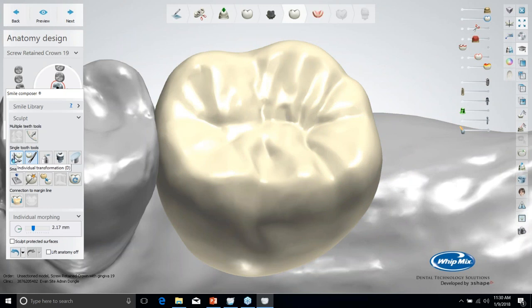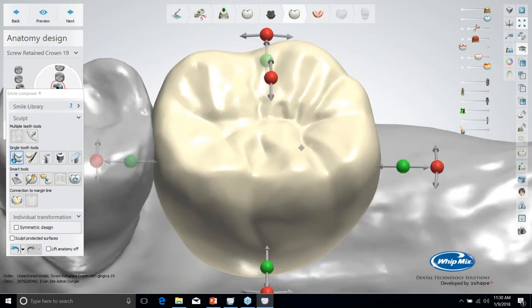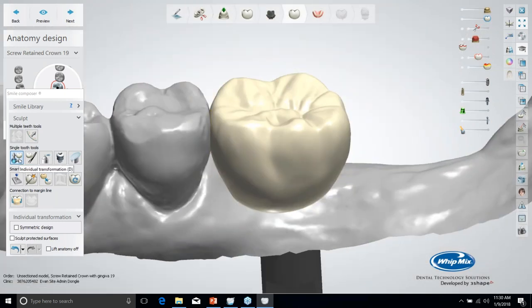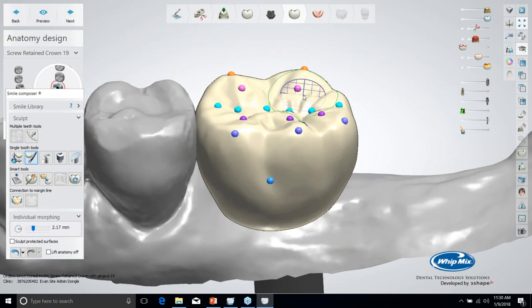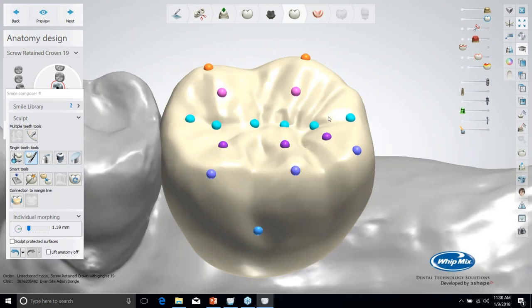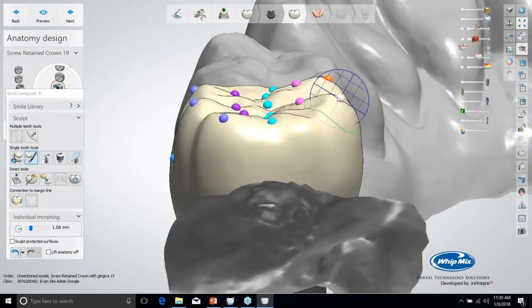But real quick, for anybody who hasn't used 3Shape or doesn't have CAD CAM, the first tool over here under single tooth tools lets you do large scale transformations to the crown. The green balls scale, red rotates, and the yellow will expand the occlusal table. So that's for large transformations. The next one is the morphing tool, and this one lets you change localized areas of the crown while maintaining the library anatomy. You also have these colored points that allow you to lock on the key features of the anatomy, as well as if I hold shift, like when I'm on these lingual cusps, then it grabs both of them, and when I make a change, it adjusts both.